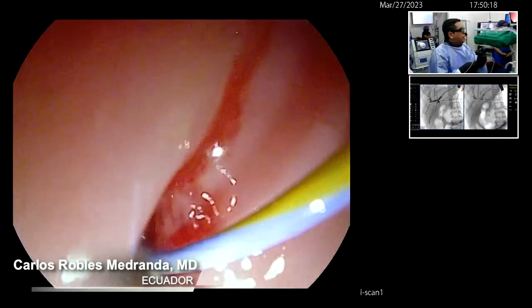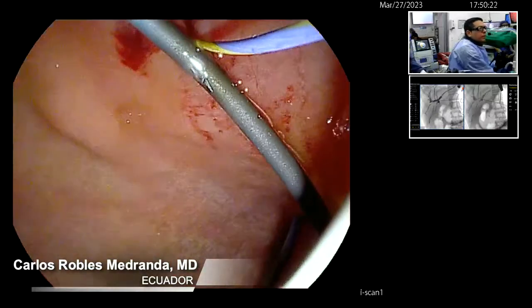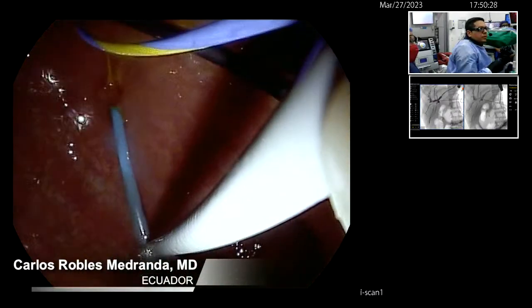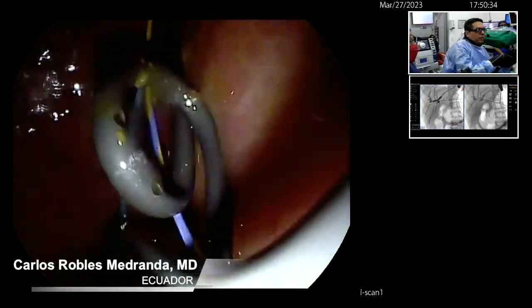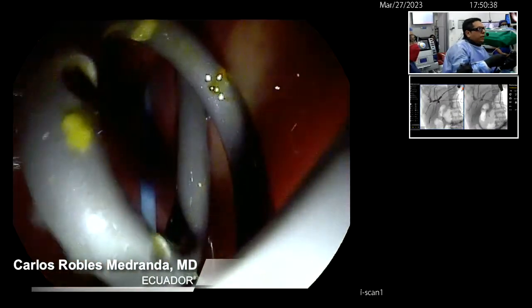Let's see. Oh my god, I lost my guide wire, I believe. Yeah, I lost my guide wire.